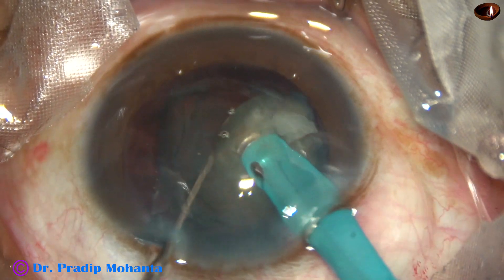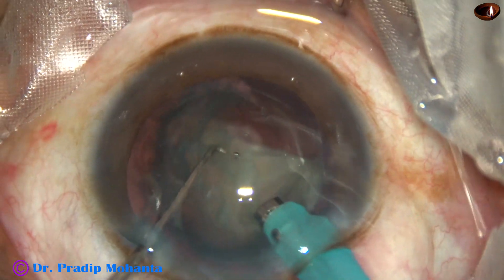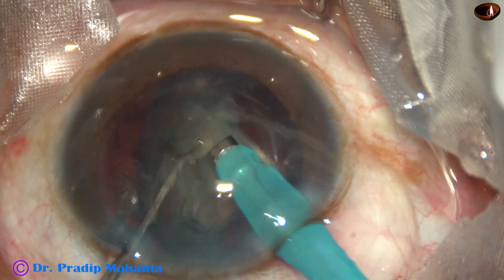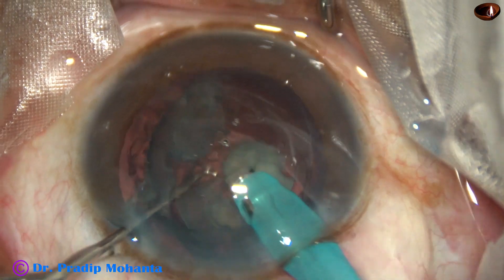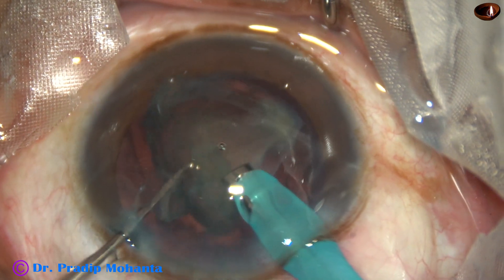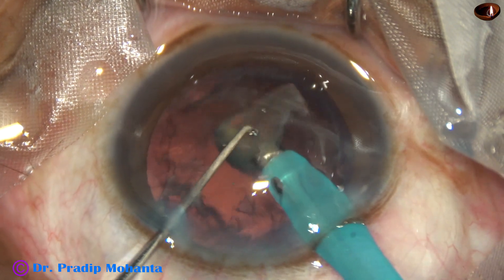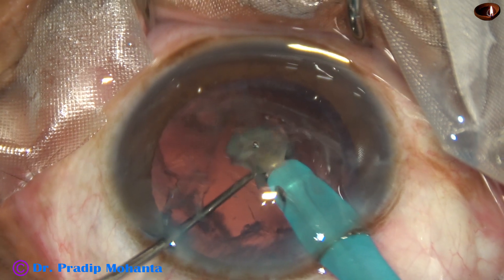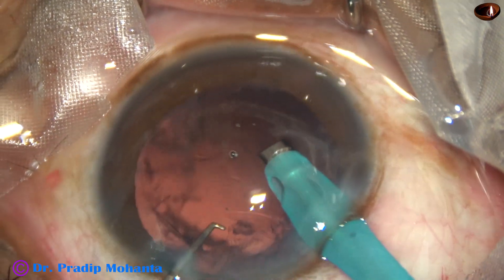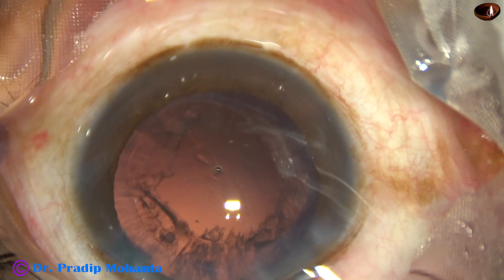We are towards the end of the management of the nucleus. This is the last nuclear fragment. I am going to remove the nucleus only and keep the epinuclear shell till the end to protect the posterior capsule. At the end, I reduce the vacuum. If I am in SPIP mode, I can control the vacuum by foot switch. And it is done.